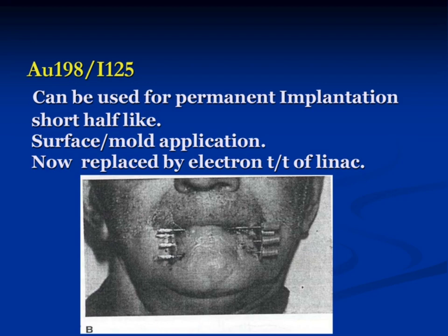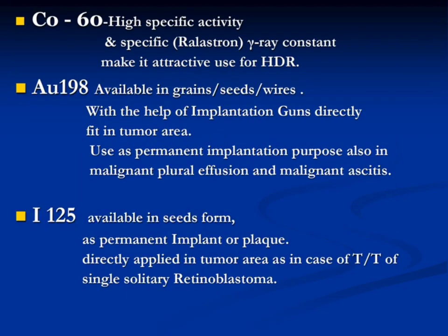Iodine 125 seeds are available in plaque form for permanent implantation as a surface applicator, used more commonly in retinoblastoma. In India, the retinoblastoma work is thoroughly being delivered at Hyderabad Apollo Hospital, and we all know Dr. Reddy is doing a wonderful job here with iodine implants, permanent implants for retinoblastoma. But you require a very, very early lesion for that kind of treatment.